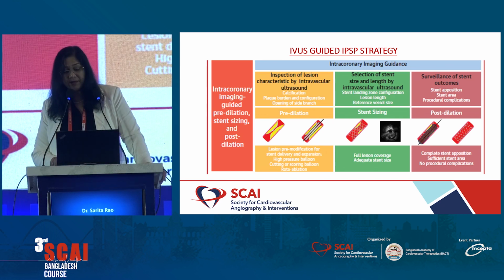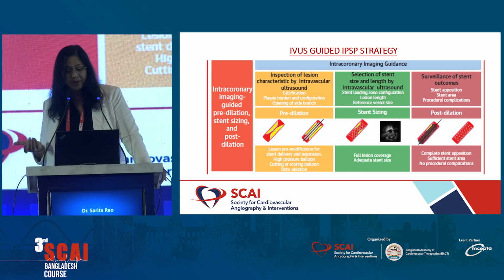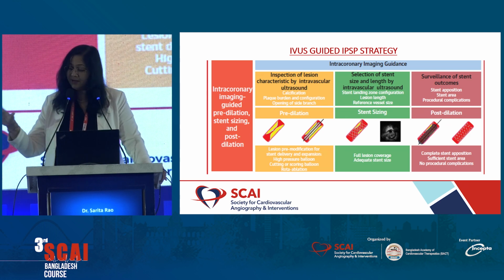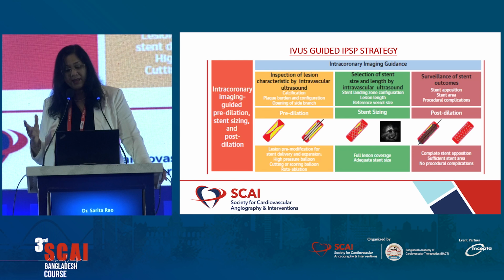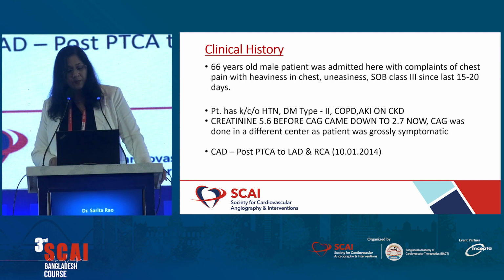So the IVUS-guided IPSP strategy is very important. Imaging-guided pre-dilatation is used to deal with the calcification, the plaque burden, the configuration, the opening of the side branch, stent sizing, landing zone configuration, lesion length, and stent apposition, and also to look for any procedural complication. So this is just a case to elucidate it.